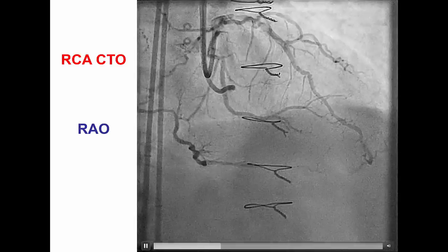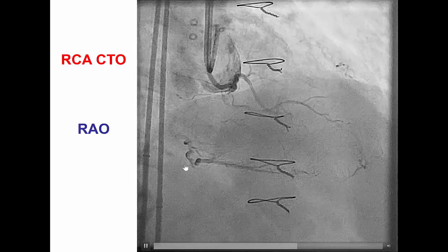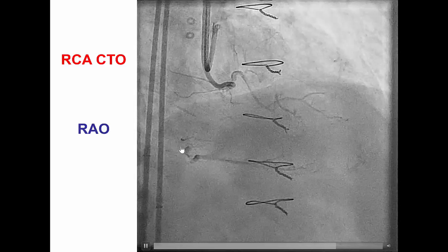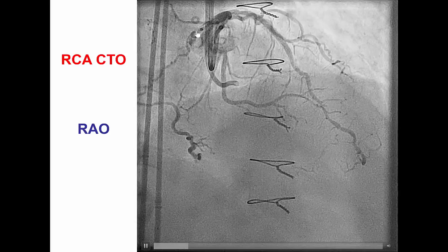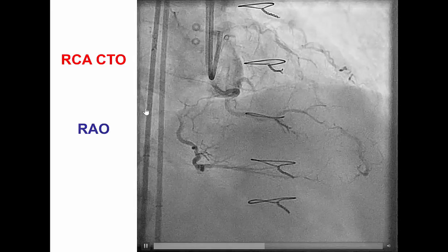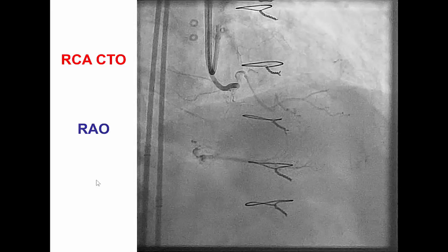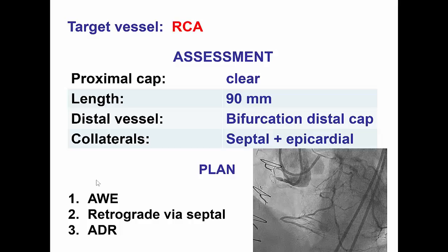This is the area of view demonstrating a good-sized distal vessel, and mainly this large tortuous epicardial collateral coming from the distal circumflex. We therefore have an RCA CTO with a clear proximal cap, a long occlusion length, a bifurcation at the distal cap at the PDA and PLV, and mainly epicardial but also some septal collaterals.